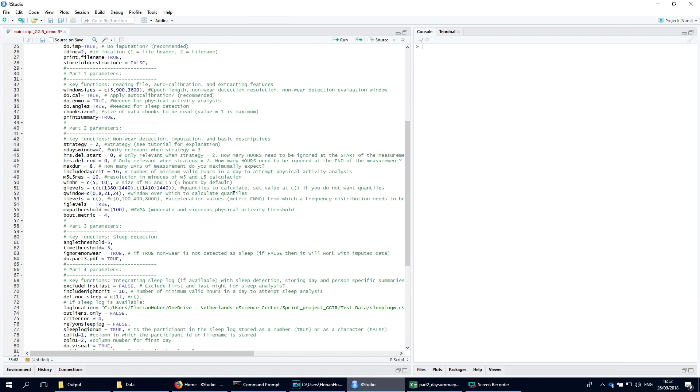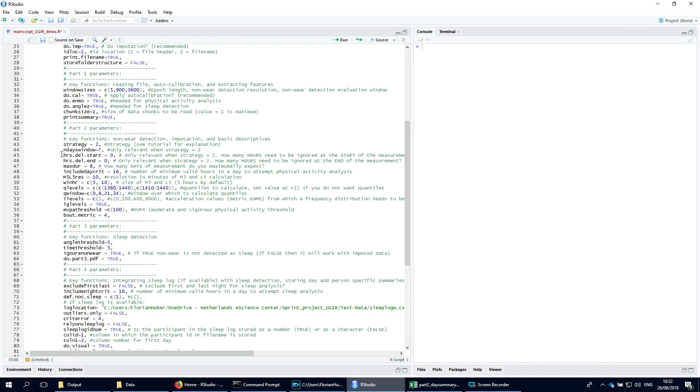Part 2 then does a generic analysis on the output of part 1. For example, it allows the user to specify which part of the signal can be ignored due to study protocol decisions. There is one argument that allows the user to specify how many hours can be ignored at the start of the recording. Next, part 2 estimates when the accelerometer is not worn and how much valid data there is left after we ignore both types of data loss.